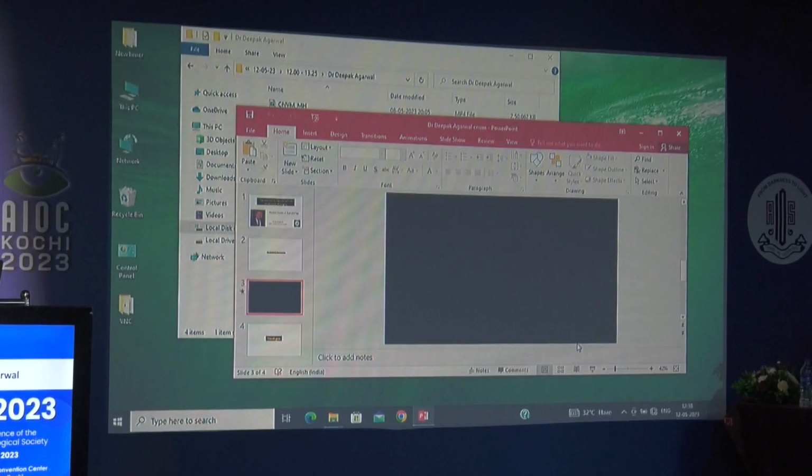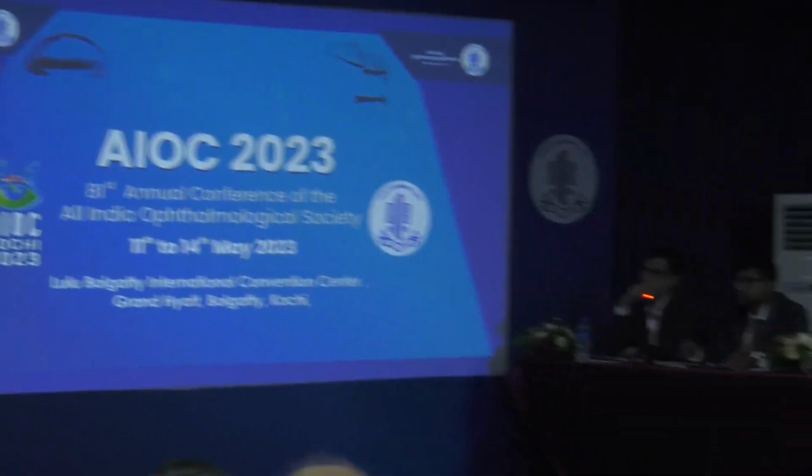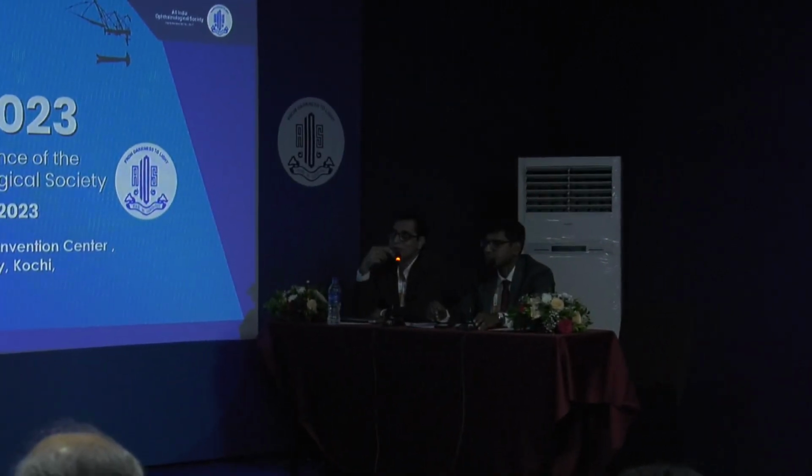Thank you, Dr. Deepak. Very nicely shown, surgery. Just one thing: what happened after? Did the CNVM come back? And how long follow-up do you have? Very fortunately, for the last 3 months, there has been no collection of fluid. Intraretinal fluid is not there. A very small pocket of SRF is there. But as per the recent guidelines from the European Society also, we are tolerating some amount of SRF. We are not injecting for very small amounts of SRF.